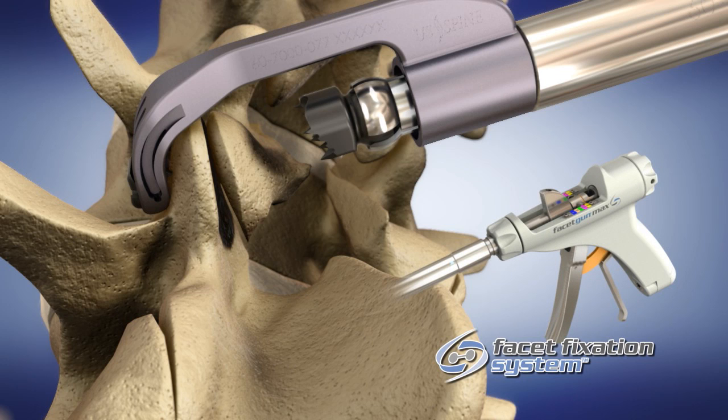This step will ensure proper grip of the implant into the bone. If necessary, the roll controller at the top of the handpiece can be used to manipulate the washer angle for proper seating on the facet surface.